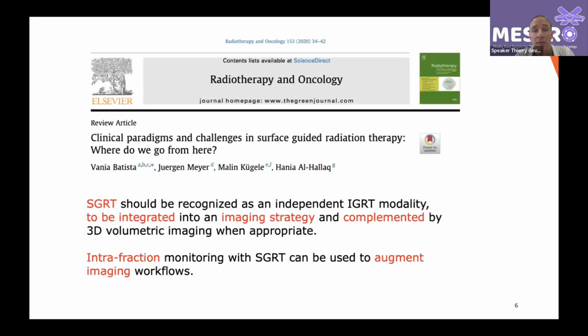In 2007, we started to do all kinds of image guidance to position our patients. As I mentioned, we want to go for fewer fractions and a higher dose while having minimum toxicity. Surface guidance is something you have to add into your daily workflow, to see whether you can use it on a daily routine or where it can add some value. But I will show directly that we believe image guidance is still important.